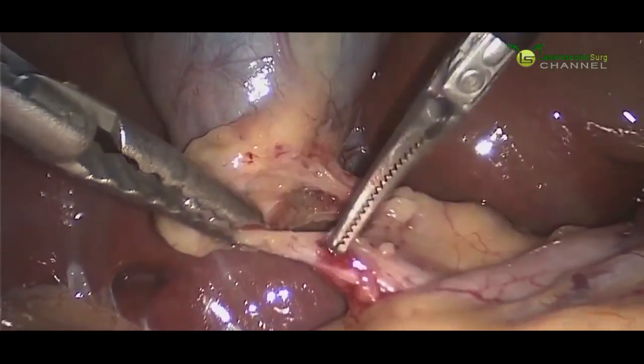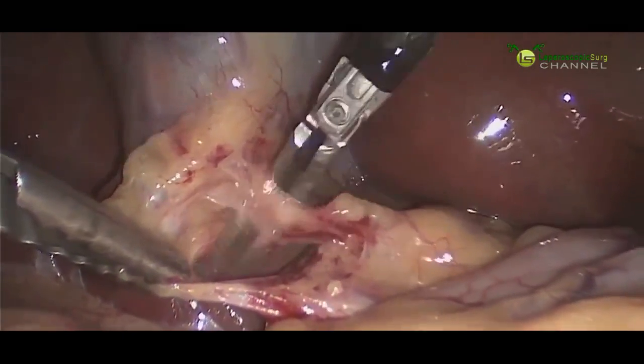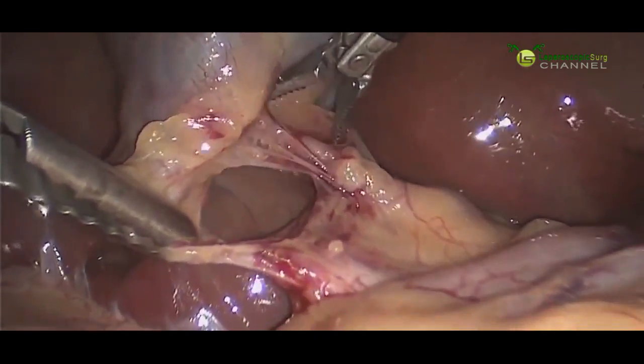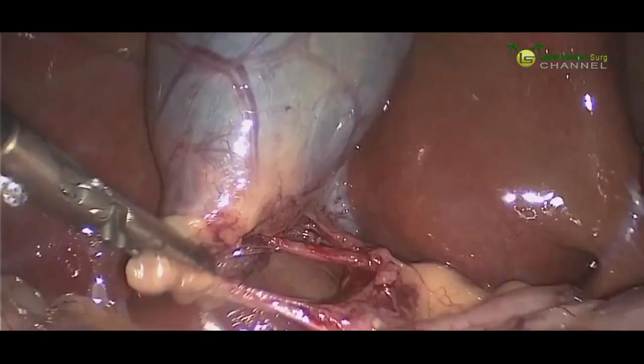Behind the cystic duct, we're going to start looking for our cystic artery, which supplies blood to the gallbladder. And you can see this pulsatile vessel coming into view now — that is the cystic artery.